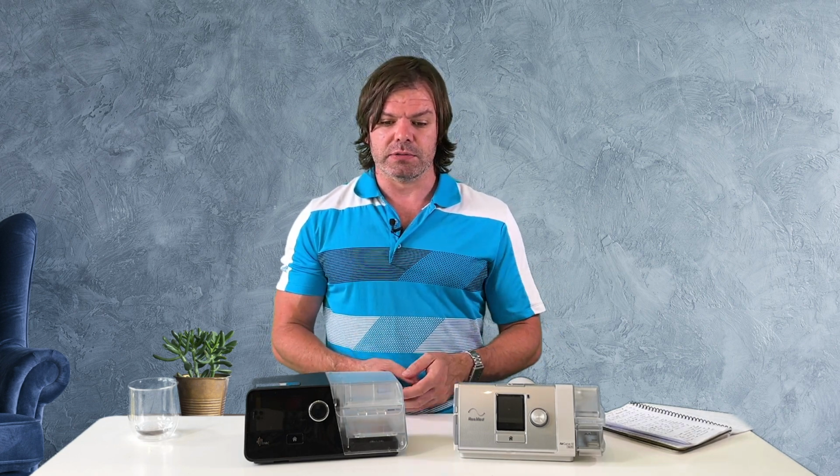And most of them have apps these days as well, so that might be something you look into. It's handy to have the data because you can use it to check and make sure that the machine is doing a good job at controlling your apnea. And I do a lot of videos on how to use your data to fine tune your therapy levels to get them working at the lowest possible rate, and it's going to make life a lot easier for you. So data is really good.